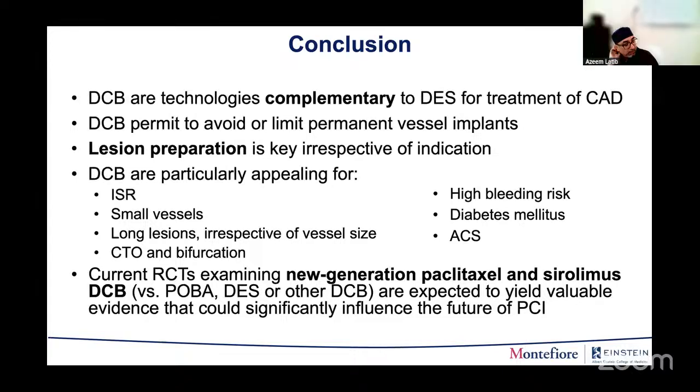Great question. There is very little data out there. There's no published data. I've been waiting for DCBs. I think we should try, because stents do very poorly in those patients. So I've been stenting those patients for years. They all come back with restenosis, aggressive restenosis, occlusive restenosis.